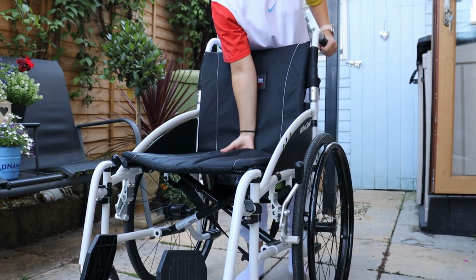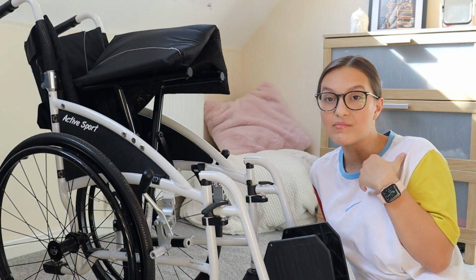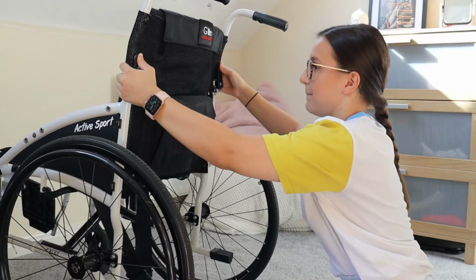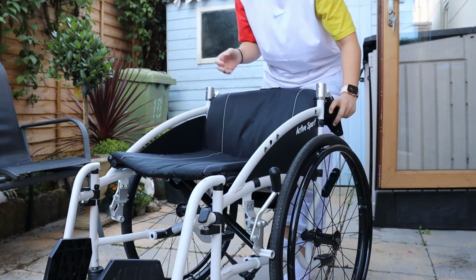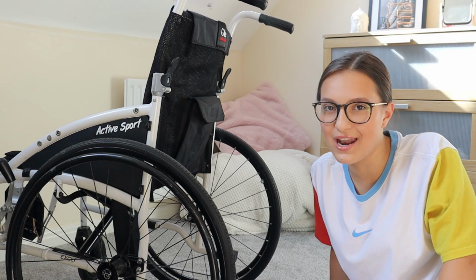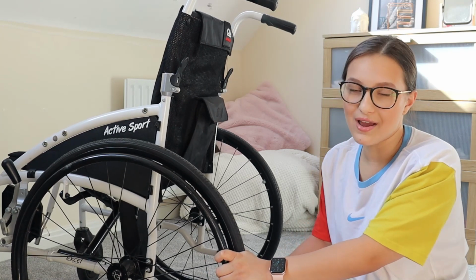The wheelchair folds up so simply. You just pull up in the middle and that is it. And if you have a tall car like my mum does, you can just fit it in like that, or you're also able to push on these black tabs at the back and the arms come down, which means that when you're folded up in a car, it has that less height on it. Now when I got my first car, it didn't actually fit, which was quite annoying, and I had to put the back seats down to put it in, which is part of the reason why I've upgraded.